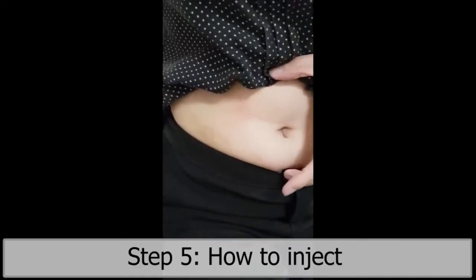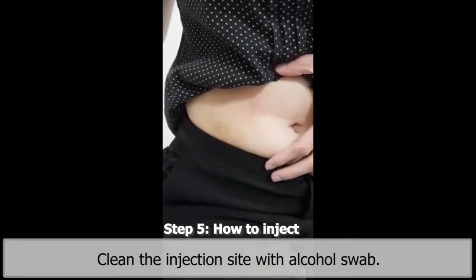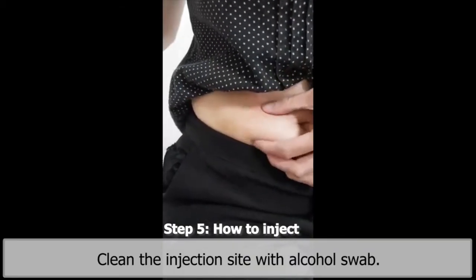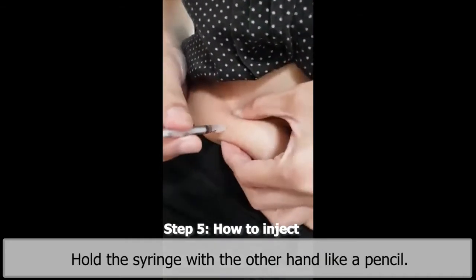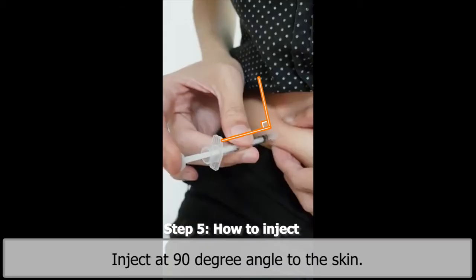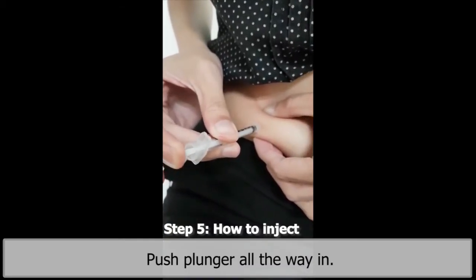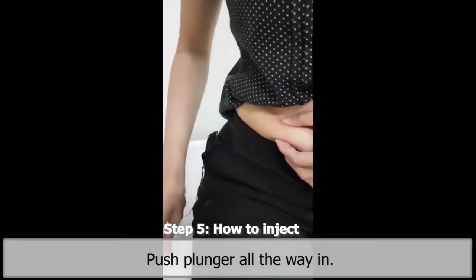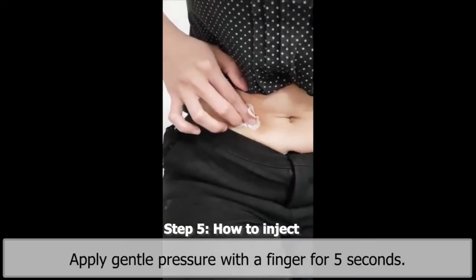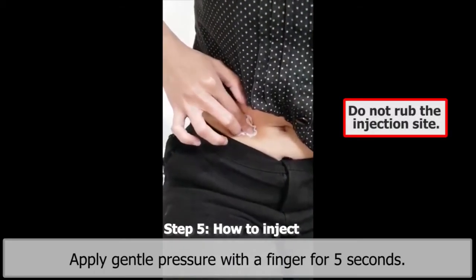Step 5. How to inject. Clean the injection site with an alcohol swab. Pinch a fold of skin. Hold the syringe with the other hand like a pencil. Inject at a 90 degree angle to the skin. Push the plunger all the way in. Remove the syringe and release the pinch at the same time. Apply gentle pressure over the injection site with a finger for five seconds. Do not rub the injection site.